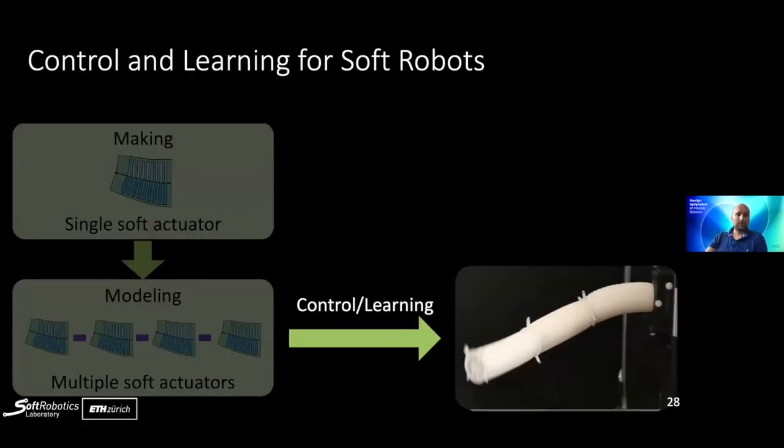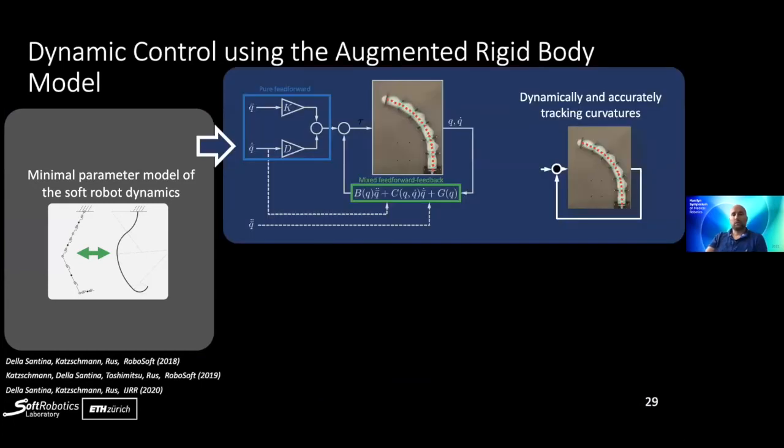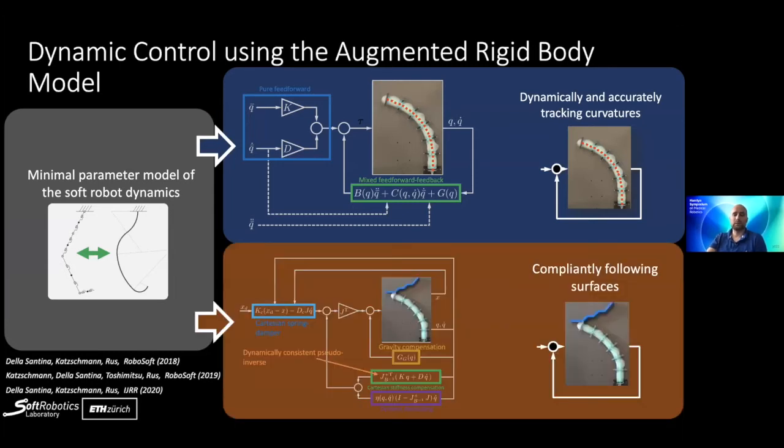All right, so this being said, we can then, for example, go ahead and apply this to our systems. For example, the soft robotic arm. We take this minimal parameter model. We then have either a curvature tracking approach. We have that approach to then track the robot arm and move it around in space and try to get minimal tracking error for this arm. We can do the same also in the Cartesian end effector space. So we've shown this so far on the 2-dimensional arm. And yeah, it so far worked fairly well on this.